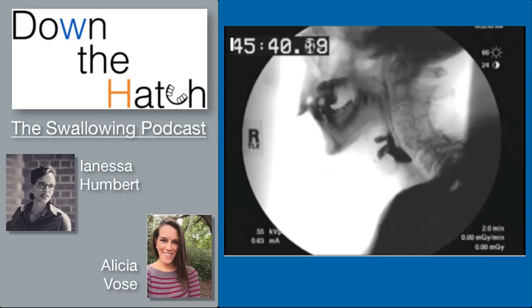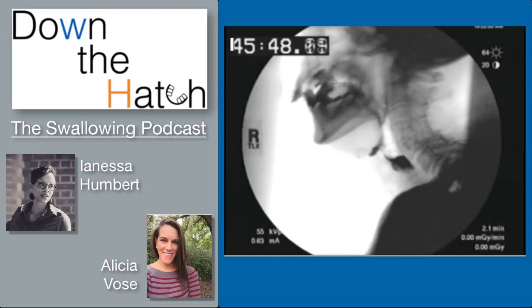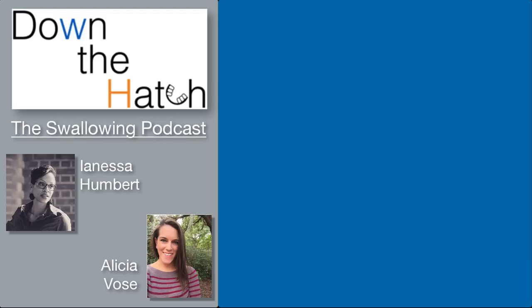It's really important to look at the big picture. Sometimes laryngeal closure gets inappropriately blamed for airway invasion when something else is happening. You can see when the bolus starts to enter the laryngeal vestibule, multiple swallows are occurring to try to eject it, but the bolus can't get into the esophagus. A lot of people might say there was a delay, or poor lingual movement, but it really ended up being related to pharyngeal and UES issues.